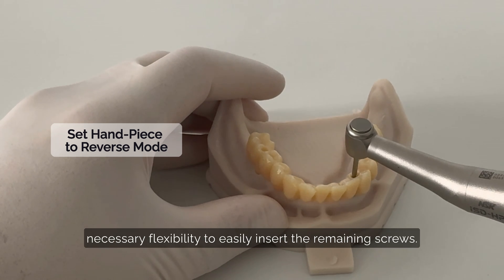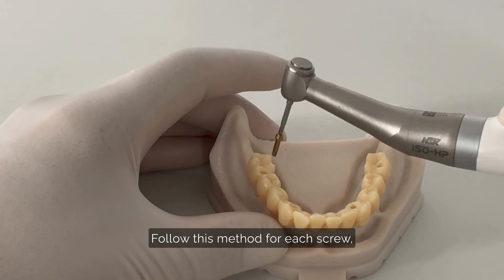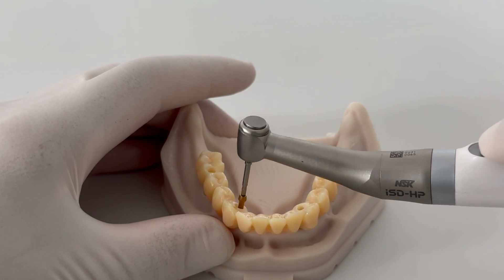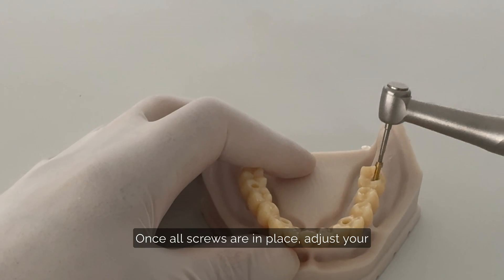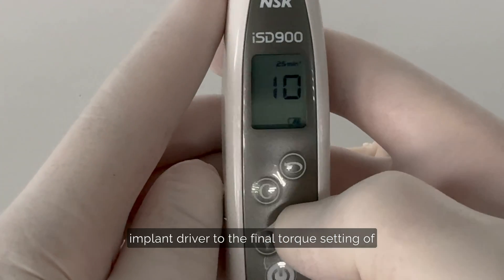This creates the necessary flexibility to easily insert the remaining screws. Follow this method for each screw — tighten, then loosen by one turn. Once all screws are in place, adjust your implant driver to the final torque setting of 15 newton centimeter for the provisional restoration.